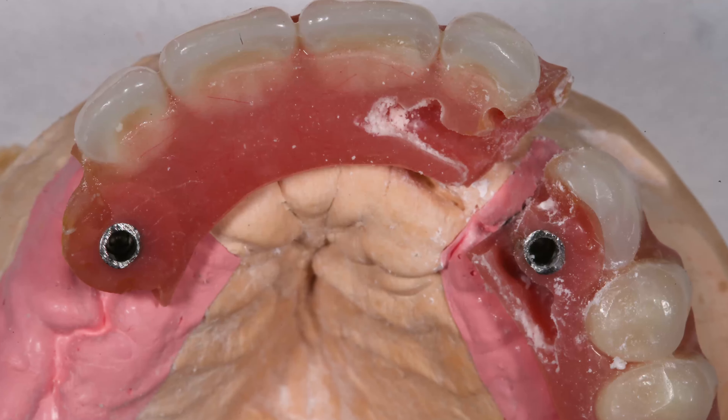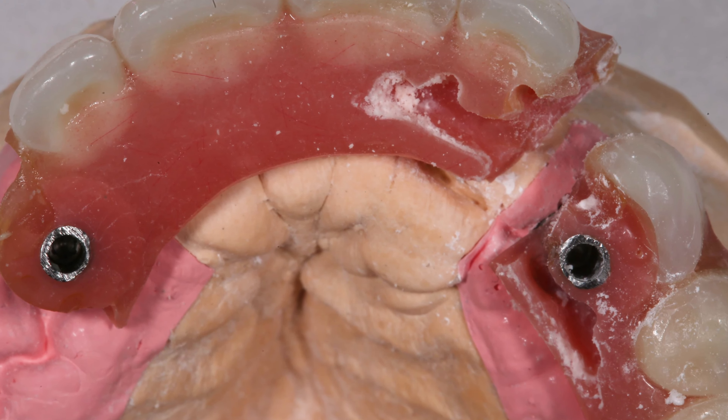And if you're having just the top or just the bottom teeth done, this may not be that big an issue because you've still got natural teeth on the opposing arch and you can judge how hard you're biting. But in this particular case, we did the top and the bottom all in one go. And the bite was really good, everything was fine. But I suspect that this lady was maybe clenching her teeth at night, and that caused breakages in the temporary dentures. And the end result was that after placing eight implants, we had to take one implant out — that early.